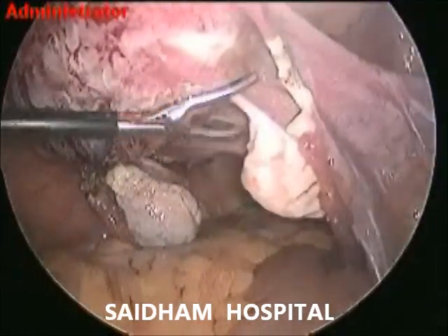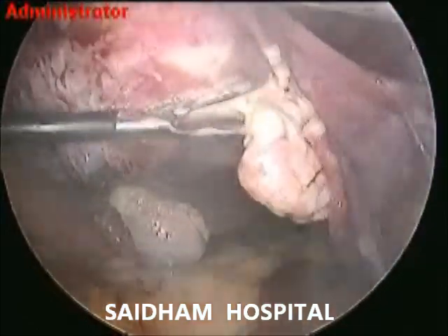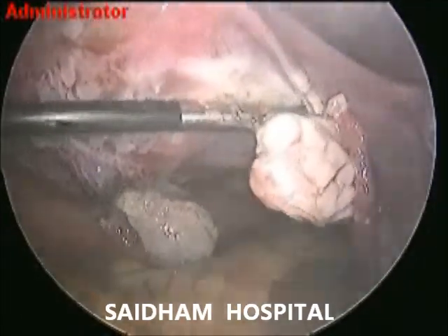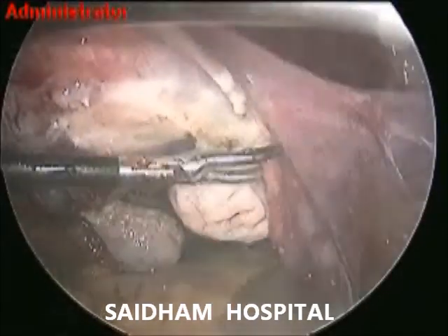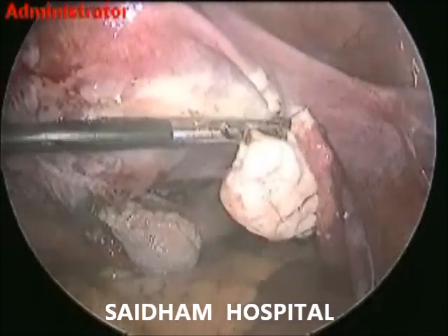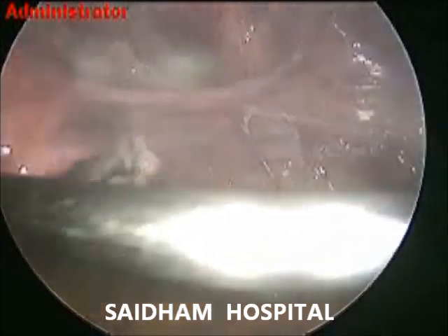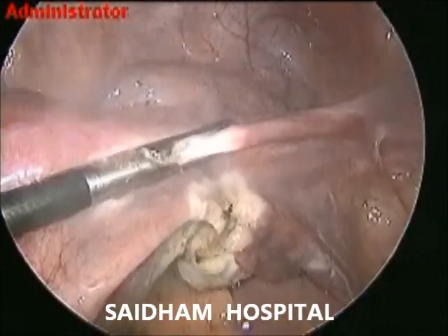The uterine manipulator screw is inserted over the fundus at the middle. Now the right side is accessible, so the utero-ovarian ligament is fully coagulated and cut. Good coagulation should be done till the air bubbles disappear and tissue gets blanched. Charring should be avoided because charring may cause excessive fog formation and may increase the risk of superadded infection in the post-operative phase.